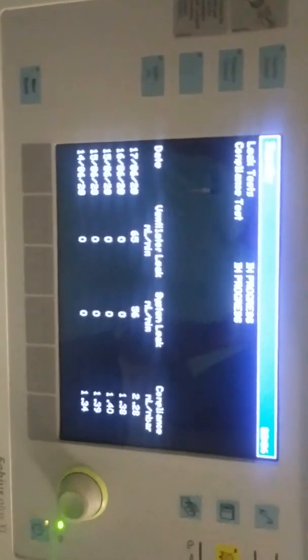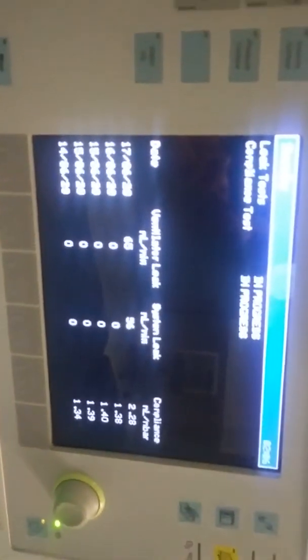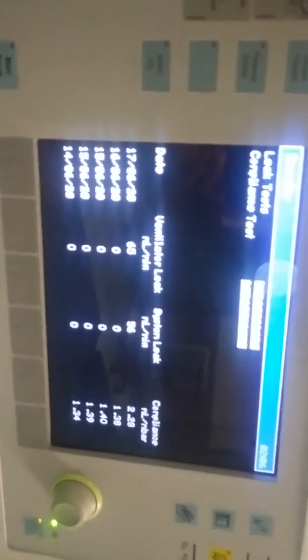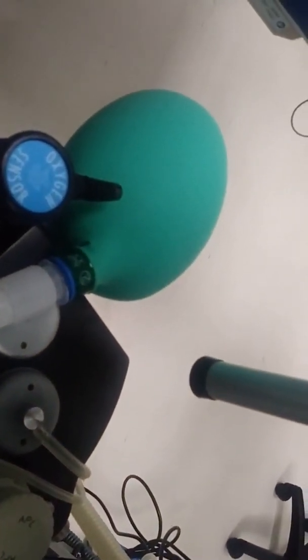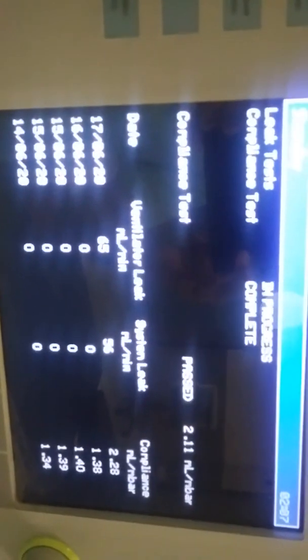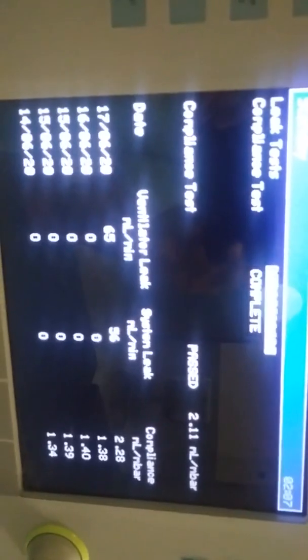A new window opens. We can see all previously leak test status and going on leak test calibration also. A little time is taken for this step. After this test we know that circuit leak, system leak, compliance of breathing system. Also we can see the reservoir bag movements and piston movements on the breathing system.